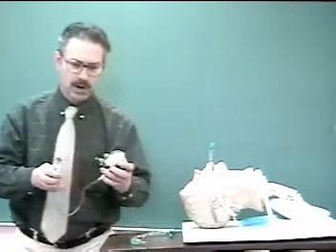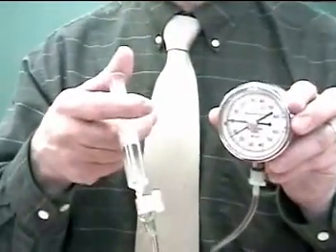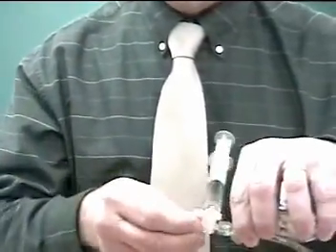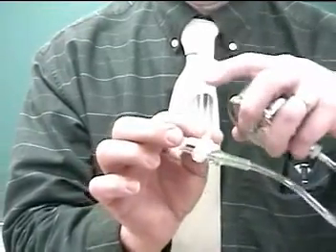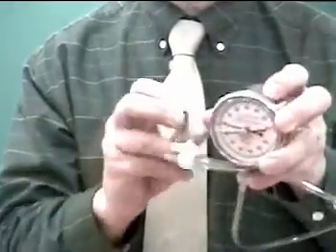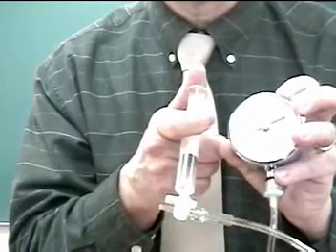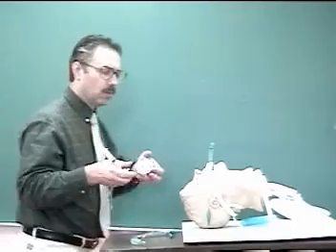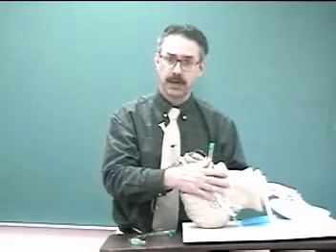But first we want to pressurize the pilot tubing and the manometer. So we're going to close off the outlet on the stopcock to the off position. Now when we inject any pressure, it will fill the tubing and the manometer gauge. We pre-pressurize to about 18, which allows us to connect to the pilot balloon without loss of volume and pressure that's filling the cuff of the patient.